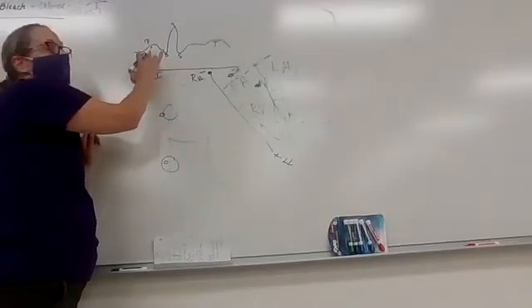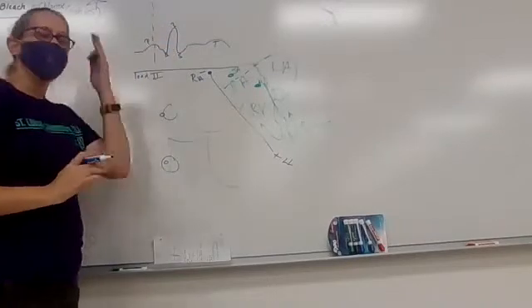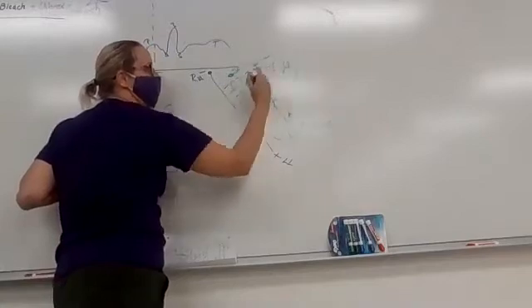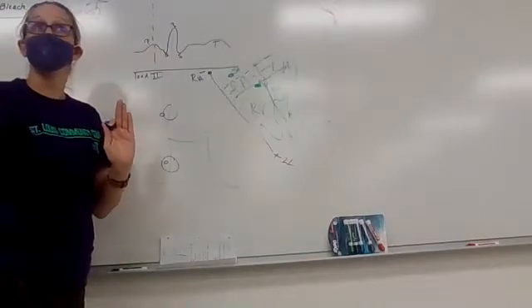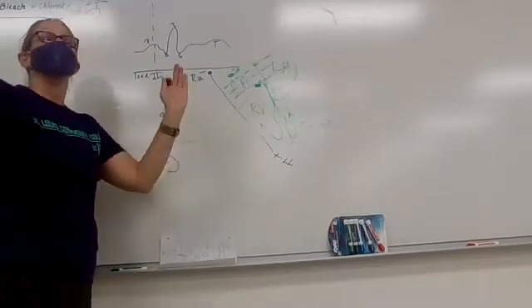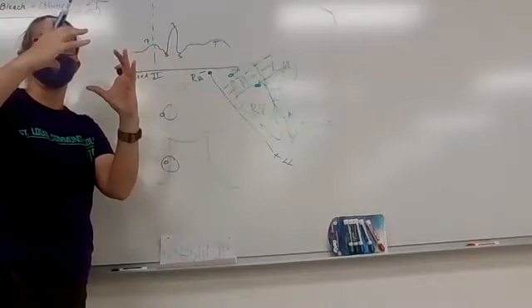And we're going to see that around the middle of the P wave, chances are that depolarization has gone through enough of the atria that if we were to then go to that cardiac cycle, what would we start to see the atria physically start to do? Enter their systole and start to contract.